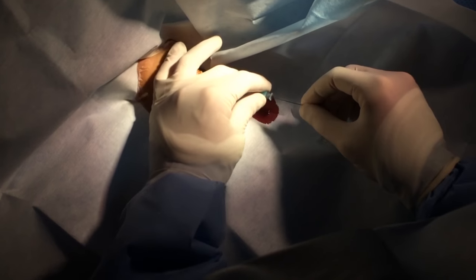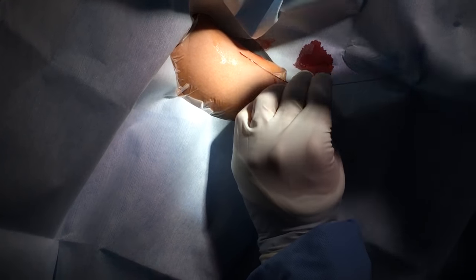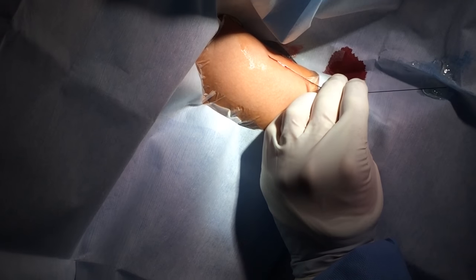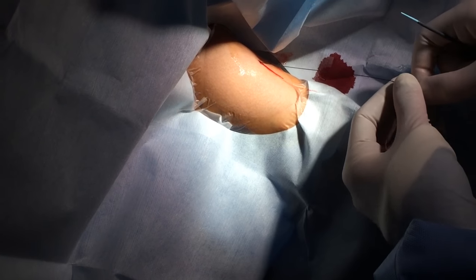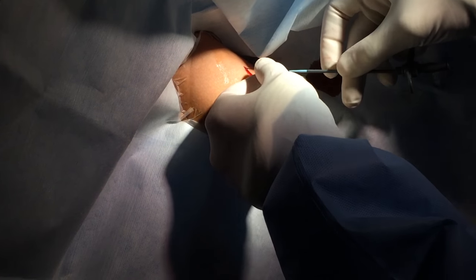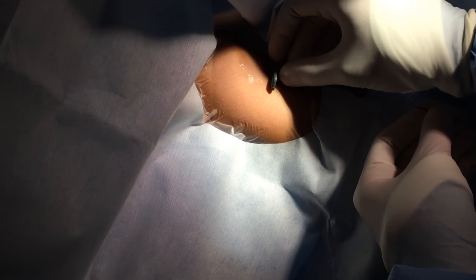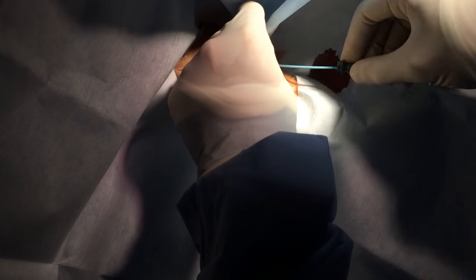Needle comes out, tourniquet goes down — we'll take down the tourniquet now. Little nick right over the wire — be careful, the vessel usually is pretty close to where the wire is on these midlines. Here comes the dilator. I'd give the other half of the lidocaine here, right above that wire where we're going to push against the skin with that dilator. He's holding the wire right close to the skin, pushing the dilator in. Went nice and smooth — no interruption, which would make you think you're kinking. Otherwise you'd rack the wire back and forth. Out comes the dilator — cover the hole.